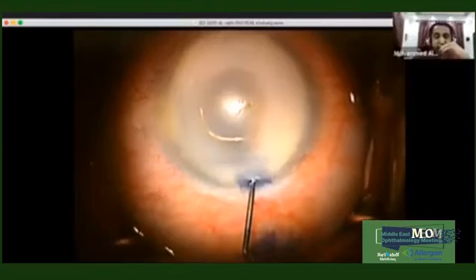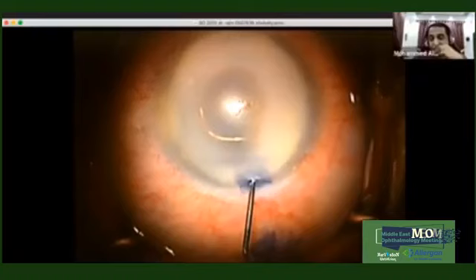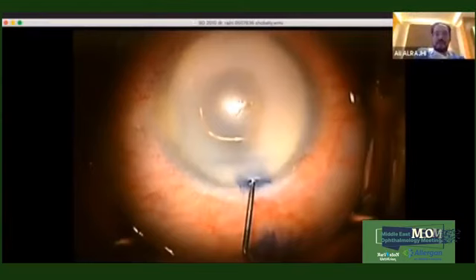Okay, Dr. Ali, can we see the second case? This patient is interesting. He had ECC in the other eye successfully. This patient presented with vision that had been corrected to 20/40 with this cornea. The question is whether to do just cataract surgery or penetrating keratoplasty. Is this a question for an opinion, or will you show the video a little? Yes, because this is a famous patient of ours, and we did this case and it has some consequences.